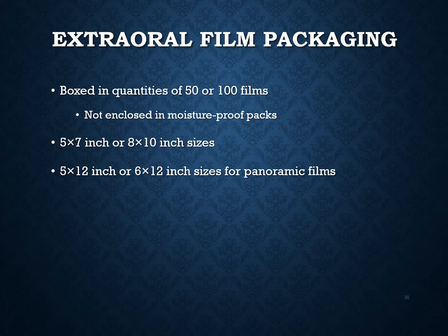And let's see, where should extraoral films be stored? Extraoral films should be stored in a dark room. This prevents them from being accidentally opened in a lighted room, which would expose them and ruin all the film. You do not want to be the one who opens this box out in the middle of everything and tries to get a film out, because it would ruin the entire box. Like that would be your last mistake.